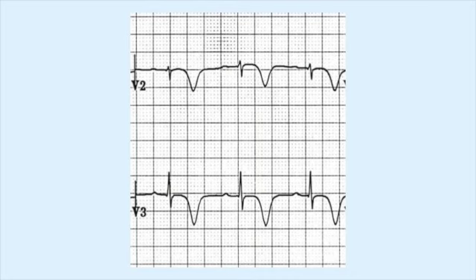One thing I was going to ask you, they say a lot of times when the patient actually has Wellens syndrome, by the time EMS gets there, their chest pain's resolved. Is that? It can. Okay. It is a high risk. You are high risk for an acute MI in the next weeks. So this, like I said, a TIA of the heart. Warning sign. So there's also a pattern B, which is deeply inverted T waves. Now, you could have deeply inverted T waves for other things like PE, but this is something concerning.